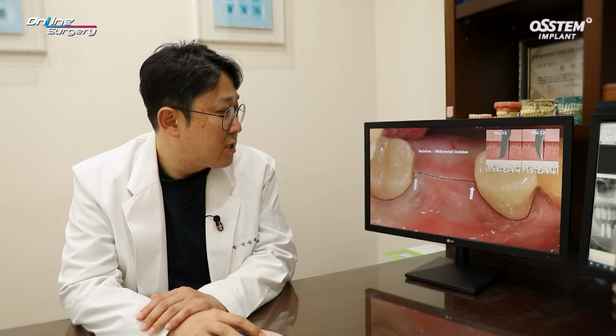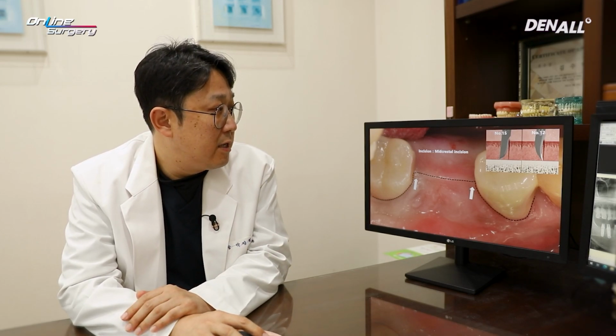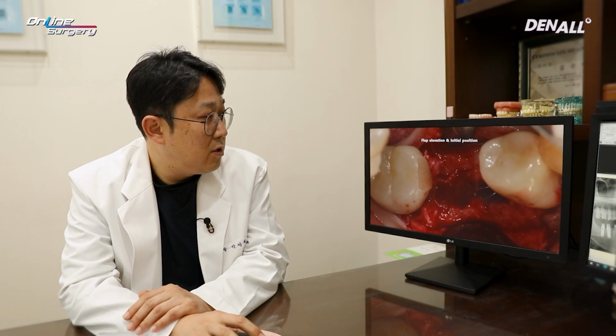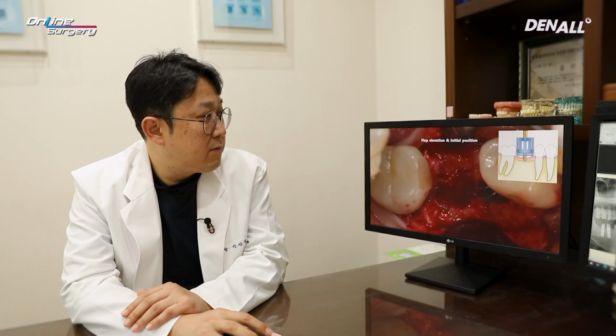In terms of raising a flap, many doctors raise a flap from the center, but if you raise a flap where two incision lines meet, it is more convenient. After raising a flap, the bone width is sufficient inside. There must have been some inflammatory tissues after tooth extraction, and the bone is not filling up the space, so we can do curettage here.